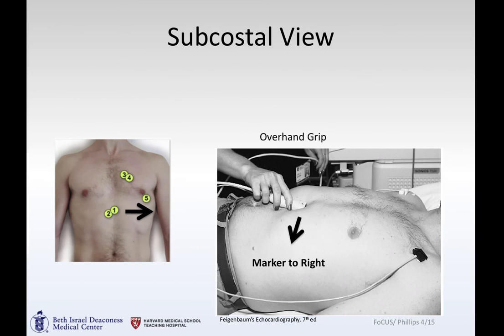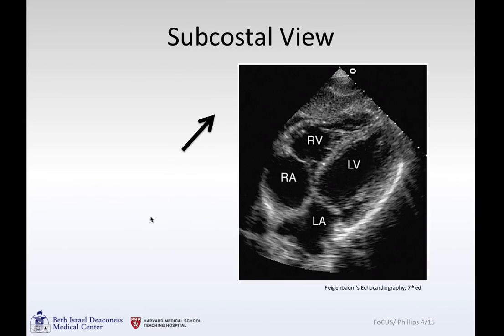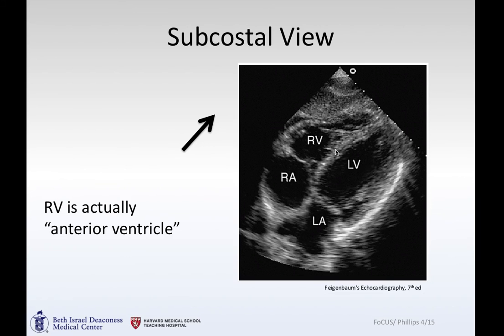To get the subcostal view, you take an overhand grip — whereas up at the parasternal position you hold the probe like a pencil, down here it's an overhand grip. Your marker is now flipped to your right, which is the patient's left. When you do that, you see the right ventricle and right atrium first, then the left ventricle and left atrium a little bit deeper. The liver is also visible in this view.